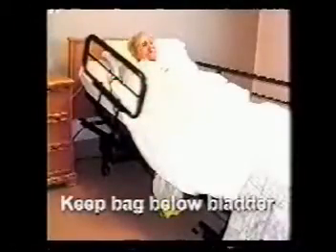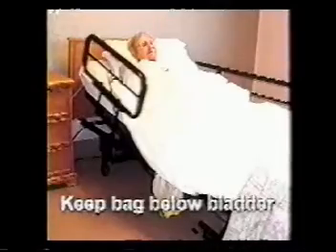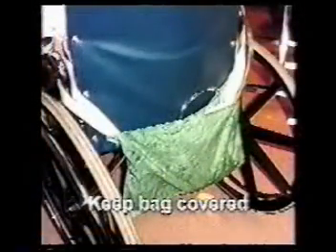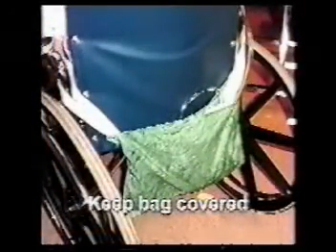Make sure the drainage bag is below the level of the catheter and the bladder. The drainage bag must be attached to the frame of the bed and not the side rail. The drainage bag should never rest on or touch the floor. Privacy and dignity is maintained at all times by covering the drainage bag with the cloth cover.